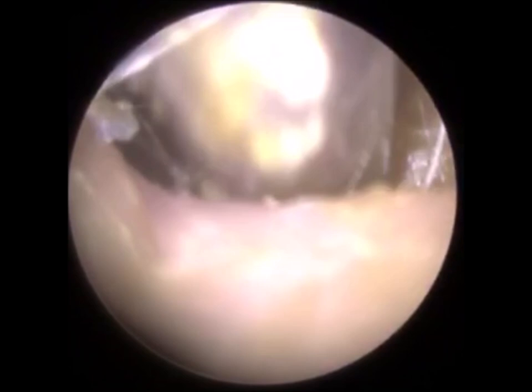I think this is probably the largest piece of them all. Take a look inside. So, bit of keratin still there, you can see. There's not a lot there now. I've got the majority of it out. And this is that cave, that trench I was talking to you about. It's a lot more visible now.